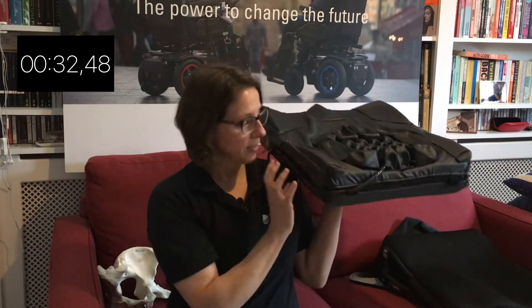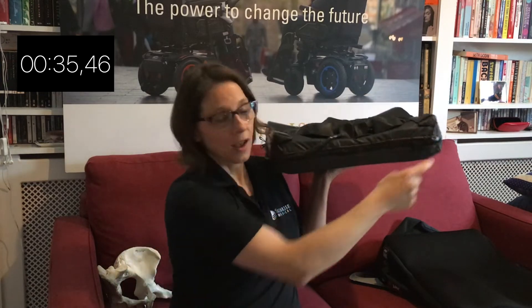You can also pop this cover in the wash. You want to make sure you unzip it, take the air insert out, and take the fluid insert out before you pop it in the wash.